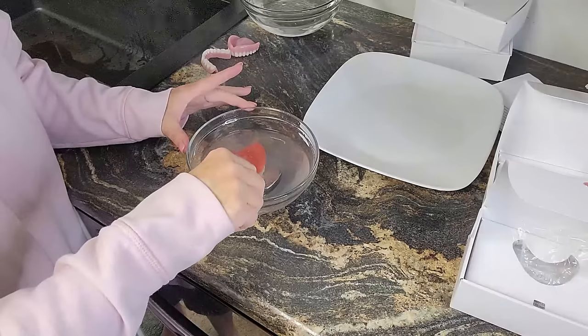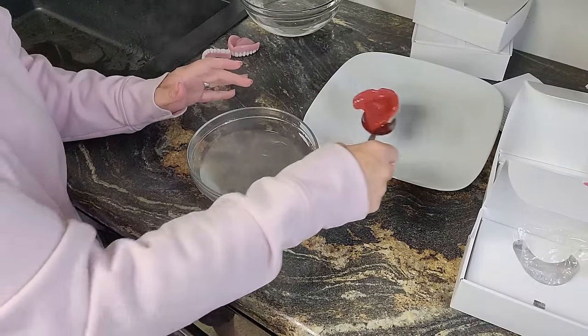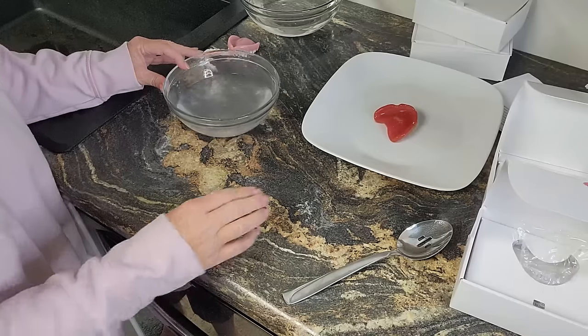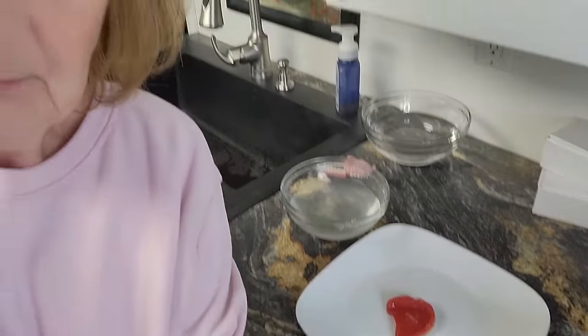60 seconds is up. We're going to take it out, scoop it out and let it sit on this plate for another 60 seconds. Then when that timer goes off we're going to put this in my mouth. And if we mess up, the good thing is we can redo it.